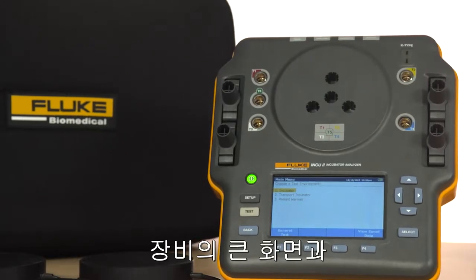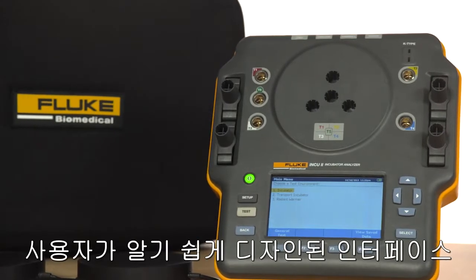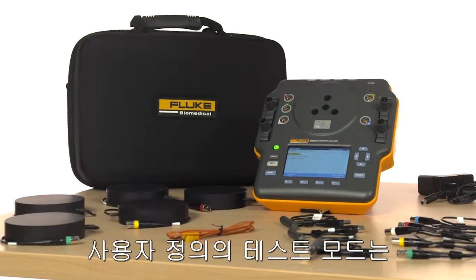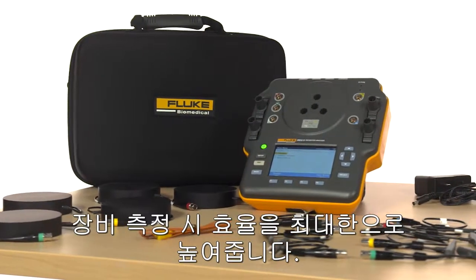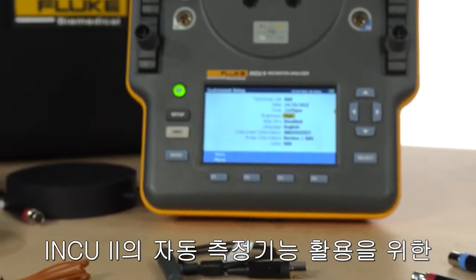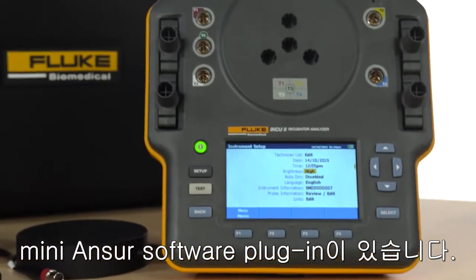You'll appreciate its large LCD screen and a user interface that's intuitive, with built-in standard and customizable test templates that maximize your testing efficiency. The INCU II has onboard automation and comes with a mini Ansur software plug-in.